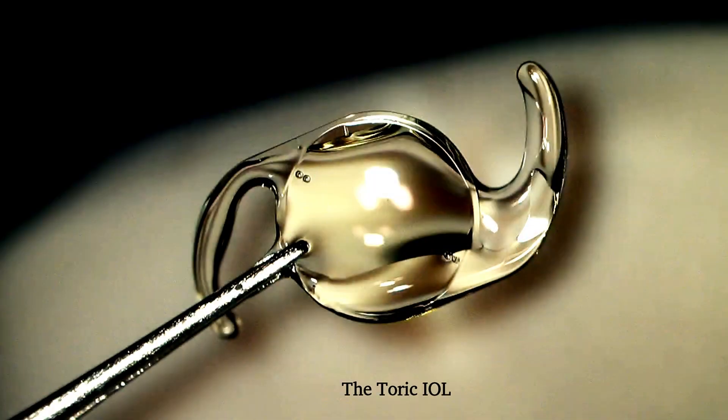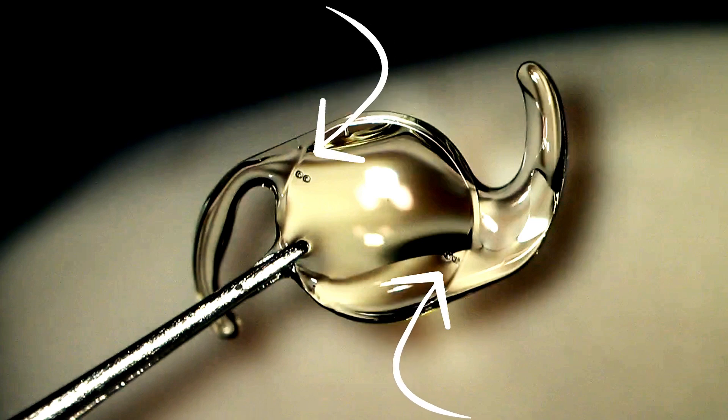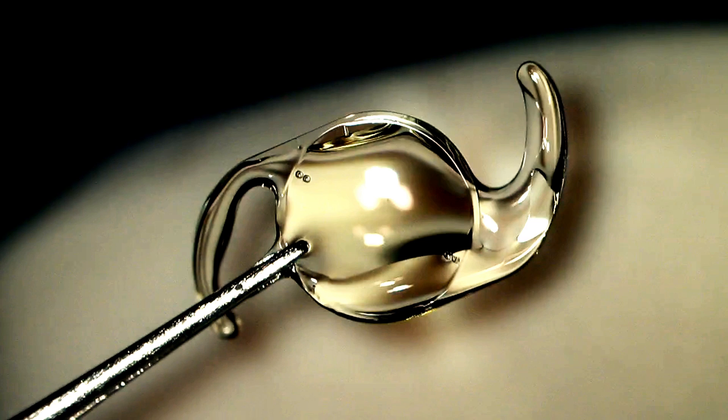Let's now learn how to load the IOL. The loading of the IOL is not really very different from any other monofocal IOL, but note how these IOLs have marks at the edge of the optic 180 degrees apart, which signifies the correct point of placement of the IOLs such as to align these dots with the marks on the cornea.